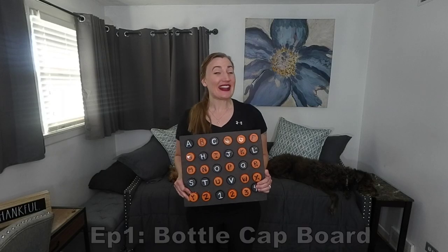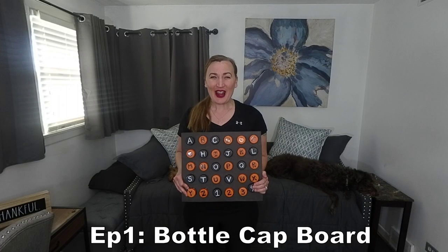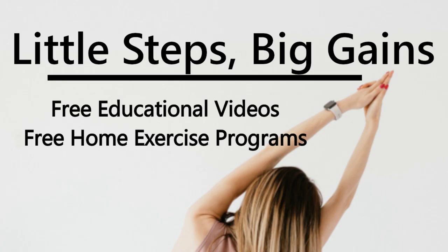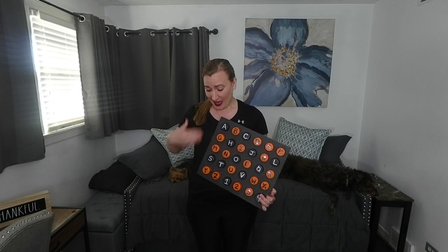Welcome to Little Steps, Big Gains in Episode 1 of the DIY OT Tools Mini Series: The Bottle Cap Board. If you're looking for an extra tool for motor dexterity or fine motor control, start saving those bottle caps, because with some hot glue and a piece of cardboard, you can create a bottle cap board.